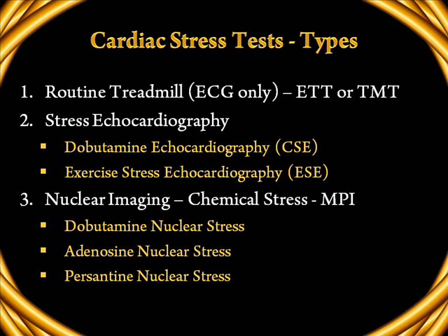Cardiac stress testing. The stress testing for the heart, we generally think, is only done by the treadmill. But in fact, we have different modalities of stress testing for the heart. What are they? Routine treadmill test monitoring the ECG only, and such a test is called in our common parlance as TMT or treadmill test, but usually in Western literature and all published literature, this test is referred to as exercise treadmill testing, called ETT.